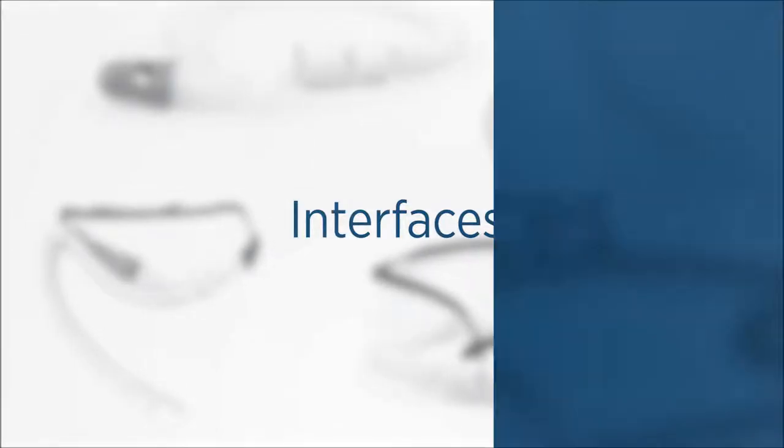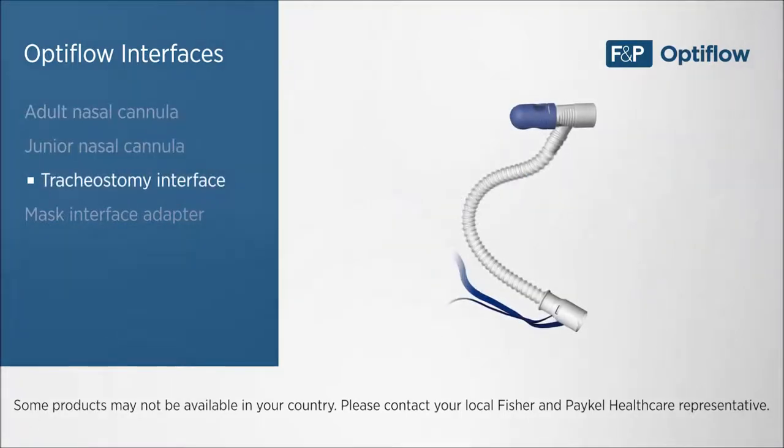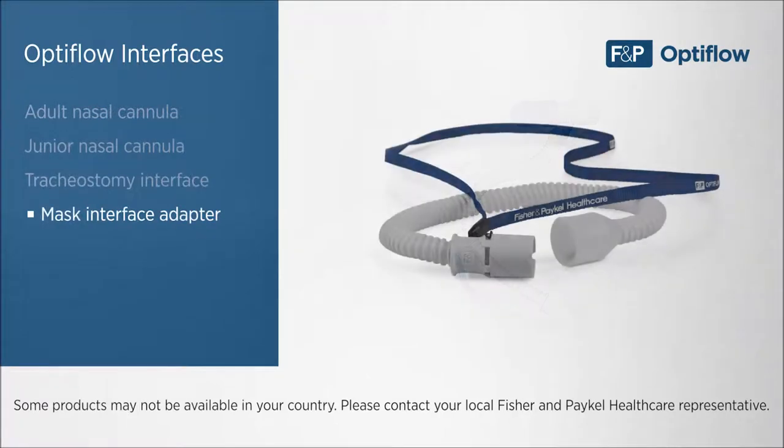A number of interfaces are available for use with the Evo2, including both an adult and junior nasal cannula, tracheostomy interface, and mask interface adapter.